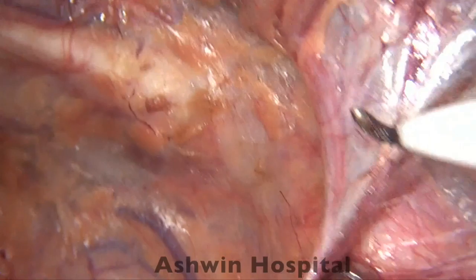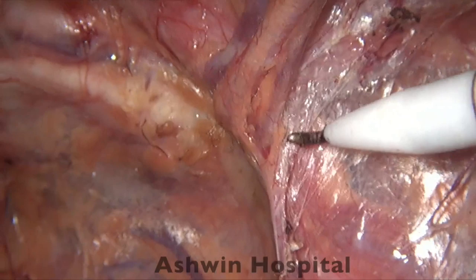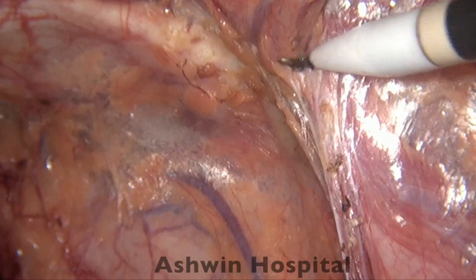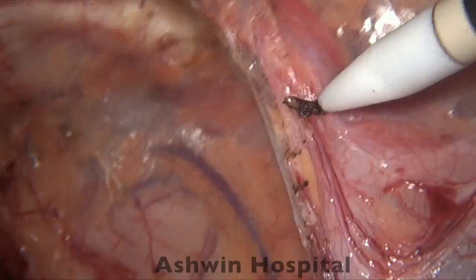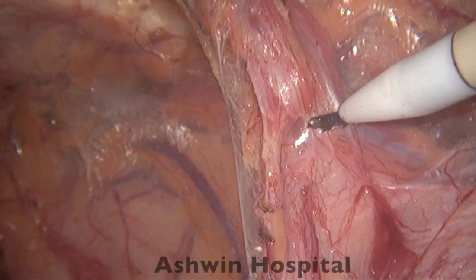at this level. So now we have created the Bogros space on both sides, and the retropubic space of Retzius also has been dissected well. Only after that are we encountering the indirect portion. A direct hernia is not too much of a trouble, as we won't really cause any buttonholes in the peritoneum. So after reducing the direct hernia, now we have come to the parietalization to see whether any indirect component of the sac is present. If it's not present, the peritoneum has to be pushed well so that the mesh can be sandwiched nicely between the pelvic sidewall and the peritoneum.